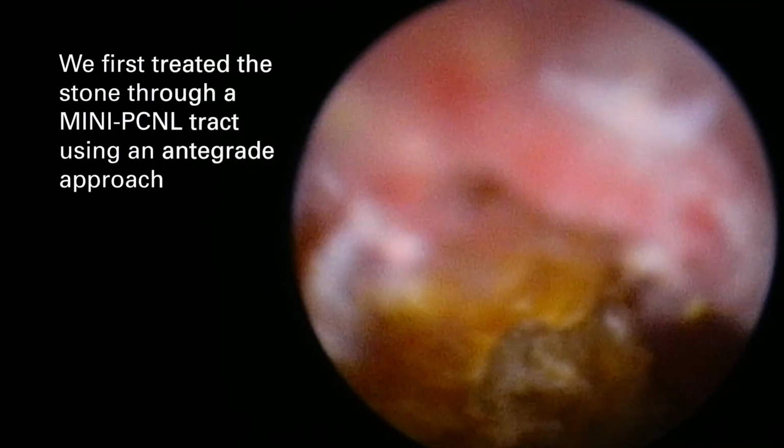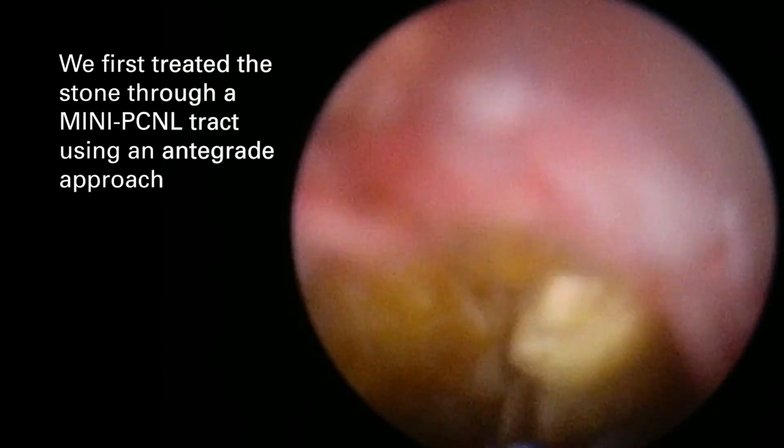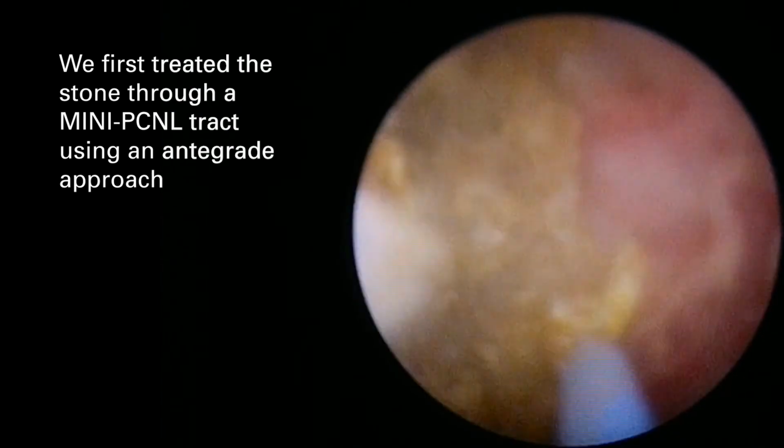The unique challenge here was to be able to get access into the kidney in the safest possible way without causing undue complications or morbidity. The other challenge was the very large stone bulk that was in the system, and being able to marry those two together in a technique and in an operation where we can do it in a single or as few procedures as possible. So the way that we overcame this was that we were able to do a mini percutaneous approach to put in an access sheath into the back. We chose a 16.5 French metal sheath that allowed us access into the kidney from an antegrade approach.